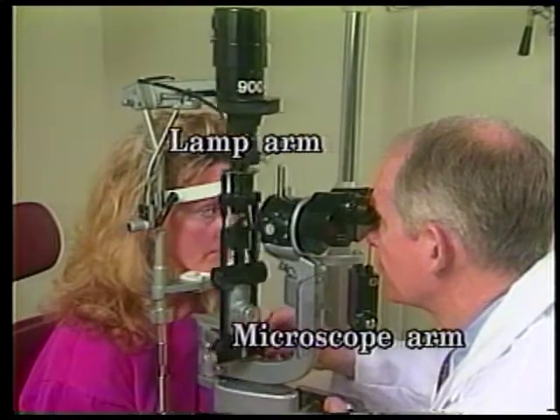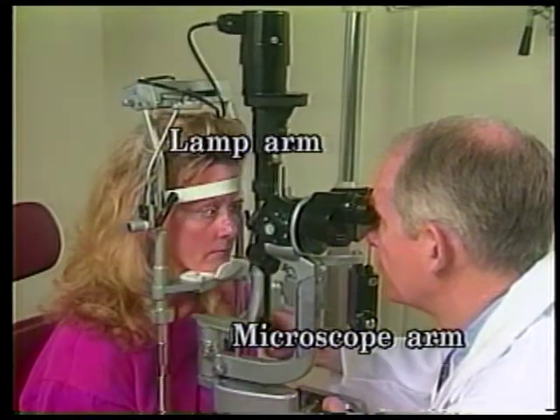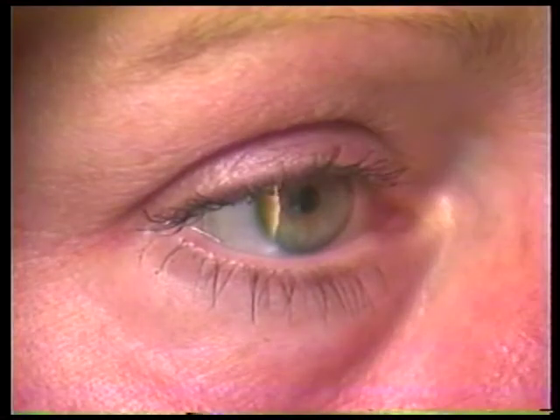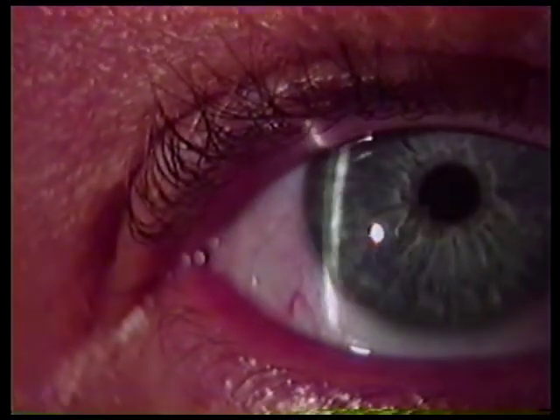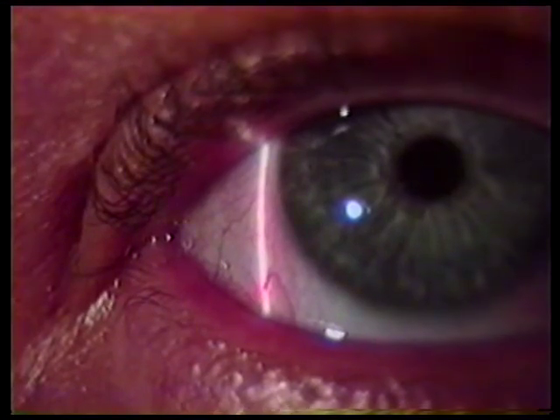The light source is coupled by a common carriage to a binocular microscope observation system. Both light and magnifier are parfocal — that is, focused at the exact same place. Therefore, when the slit beam is seen in sharp focus, the object on which it is focused will be clearly seen through the oculars. Fine manipulations of the slit beam can then aid in evaluating an area of interest or abnormality, such as this corneal scar.